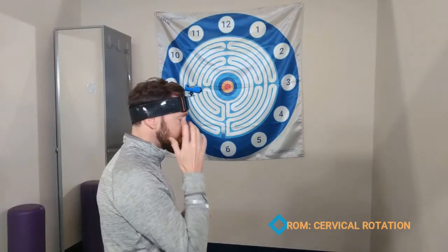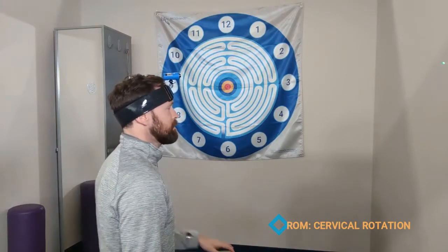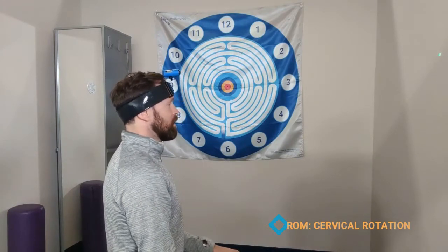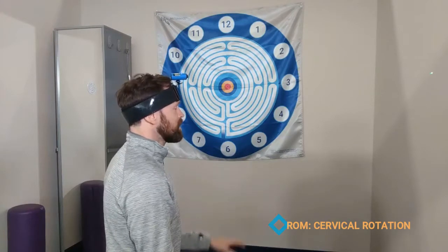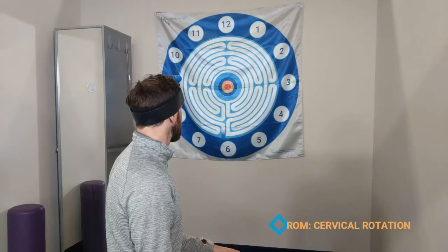Let's say in this case a patient was limited in rotation left. On a rolling stool or in standing, I could have them aim with the seat a little bit to the right and then try to rotate left to get to a number — let's say the three.